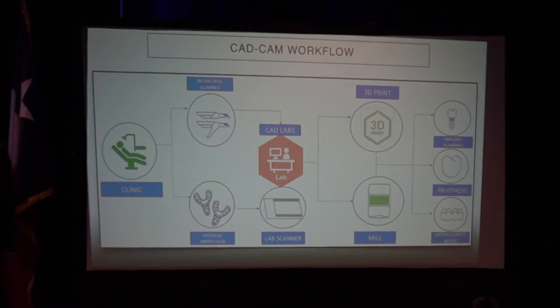And you have to ask yourself, am I going to be able to pay for a digital scanner? Well, you can if you're going to use it. The downside is that an iTero scanner has a high monthly subscription fee. It costs about $360 for the first unit, and then they'll charge you $180 for the second unit. So that's a high cost. You've got to compare it to a PVS impression, which they said is $25. Are you going to do enough units to pay for that?